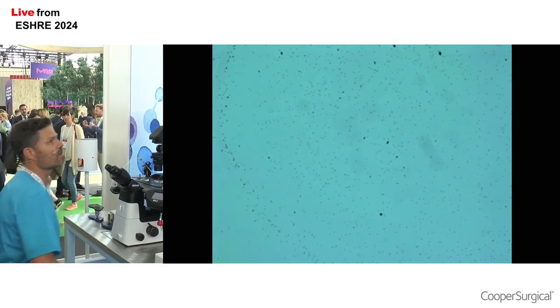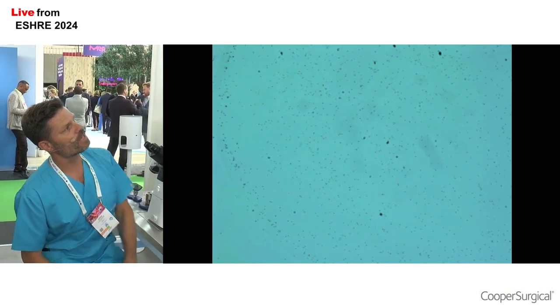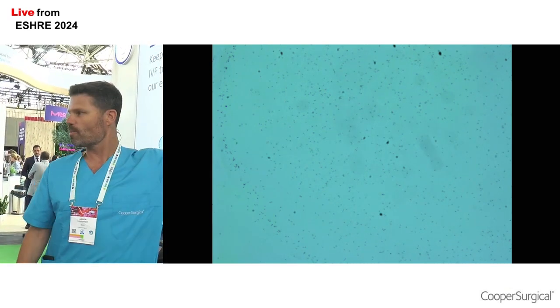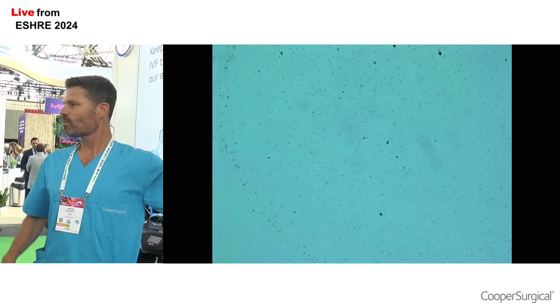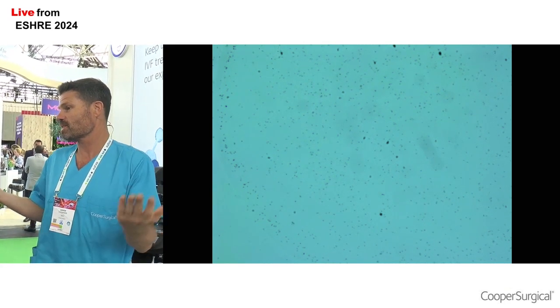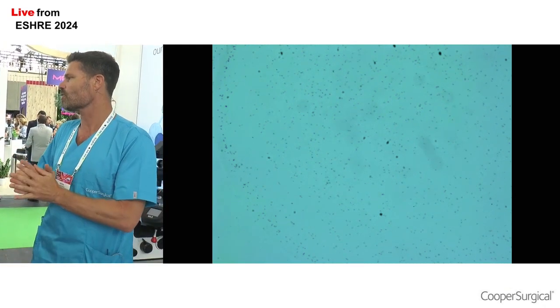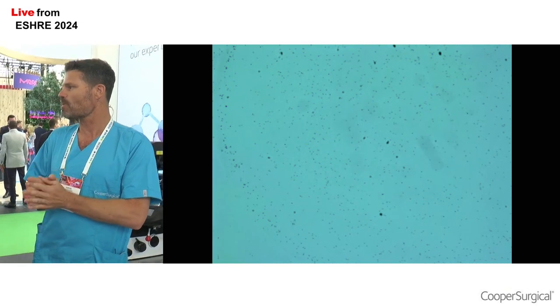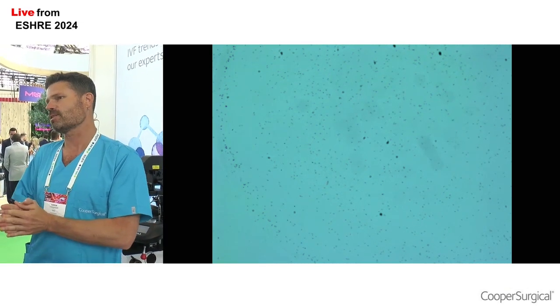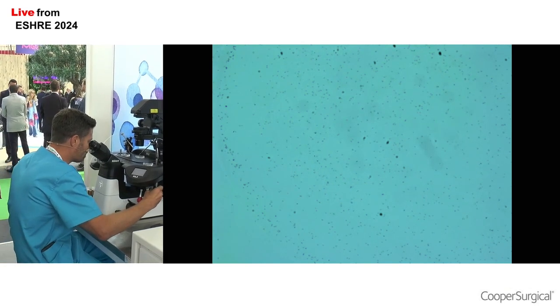So let's have a look and see if we can see a bit better. Hopefully everyone can see there are some motile sperm there which are not bound. In this case, if you did a normal ICSI, we might select these sperm because they look like they're fine, they have good motility, good morphology. But these are not the sperm we want because these are the sperm that may have more DNA fragmentation. So let's go to a higher magnification and see if we can see the effect.